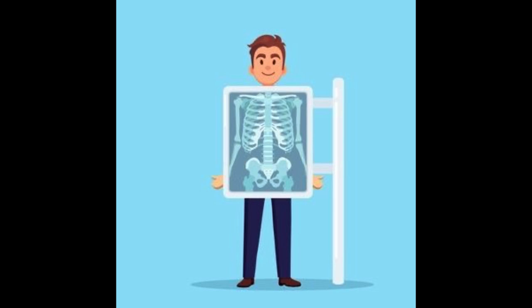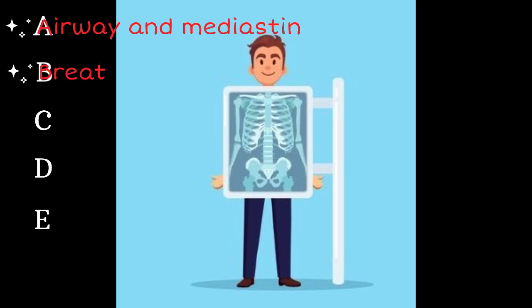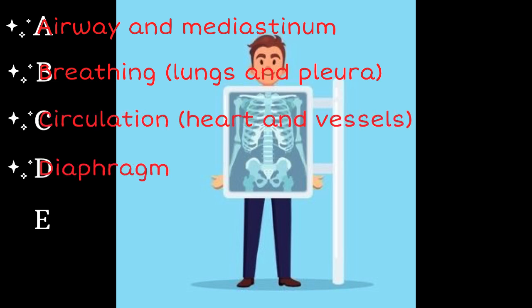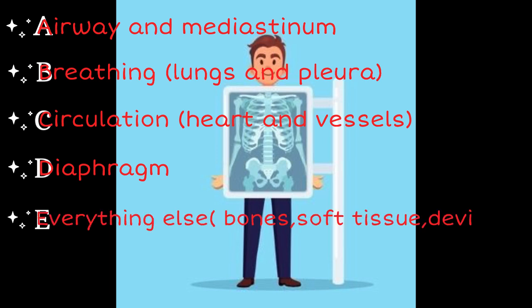Chest X-ray interpretation should be done using the ABCDE approach. A stands for airway and mediastinum. B stands for breathing — lungs and pleura should be assessed. C stands for circulation — heart and vessels should be visualized. D stands for diaphragm. E stands for everything else, i.e., bones, soft tissue, and devices.